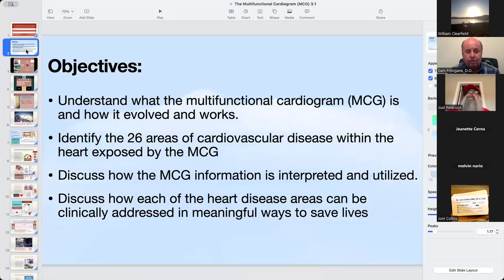This is going to replace calcium scoring because it's much more advanced. It sees everything calcium scoring sees, but sees a lot more. Not all plaque is calcified, so this will see the plaque that's not calcified, but it will also see things like small vessel disease, and we'll get into all the details of other things it sees, which makes it incredibly, it's like college and kindergarten to a calcium scanner.